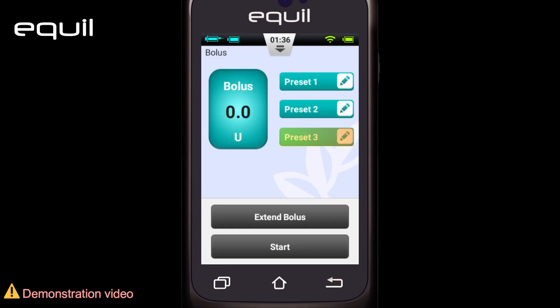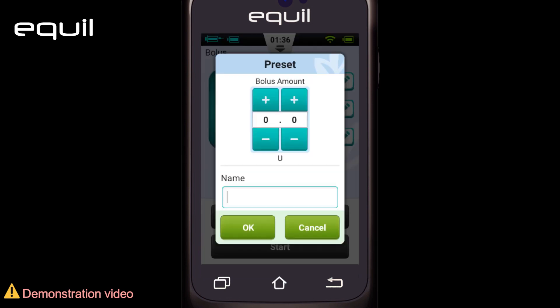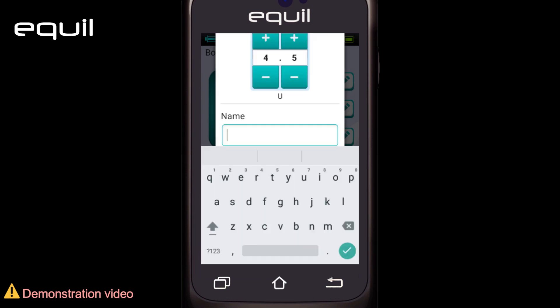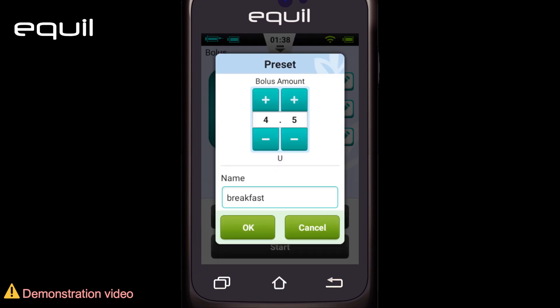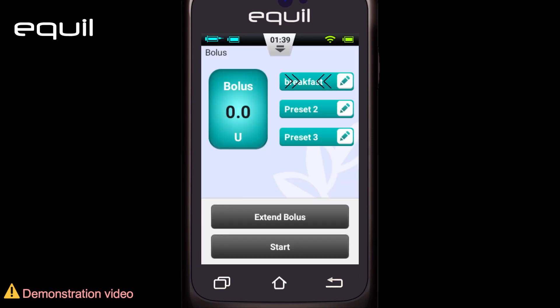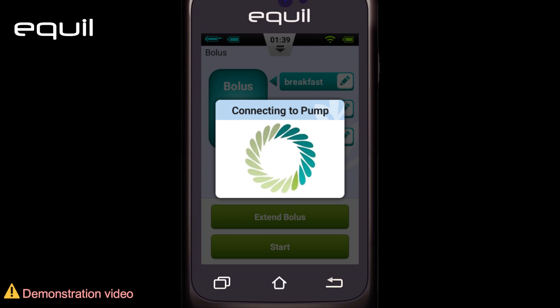The bolus screen contains three programmable preset bolus buttons. Press the edit icon to open the preset dialog box. Adjust the value using the plus and minus buttons. Make a name for it and click OK. Press the left area of the button and its predefined value will be displayed inside the bolus button box to the far left. A small arrow will appear that links the selected preset button to the bolus amount box. You'll get a green start button — continue as before.